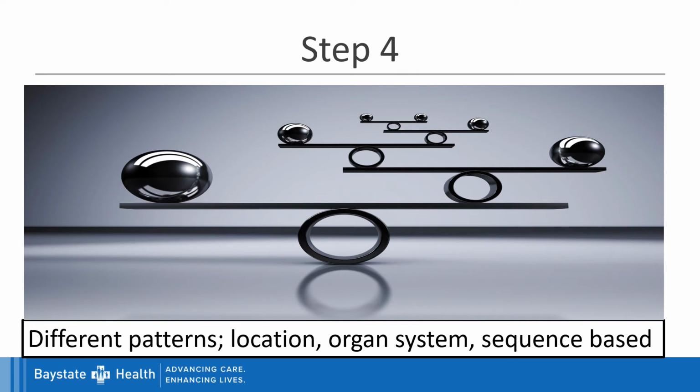Step 4 is about the search pattern. Everyone has a different search pattern. Just because I use one particular one doesn't mean that it will work for you. Everyone has their own way of looking at things. Particularly true for individuals who learned how to read cases on film before PACS systems came into play. There are a variety of ways that you can use these search patterns.